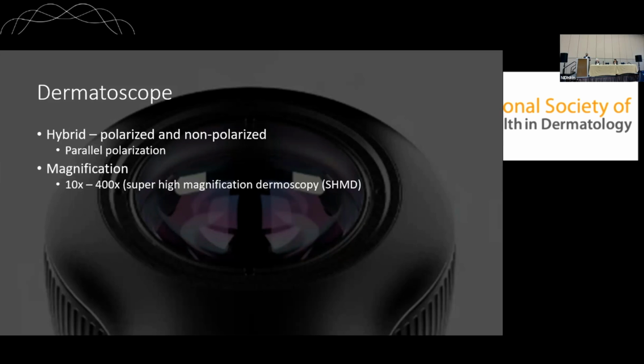Magnification, we would love it to be as big as possible. I always used to use a small iPad attached to my dermatoscope every time I took a picture. And the beauty of it is, when a patient sees it, they say, oh wow, that looks nasty. That looks bad. Even if it's a seborrheic keratosis, that would look bad to them.